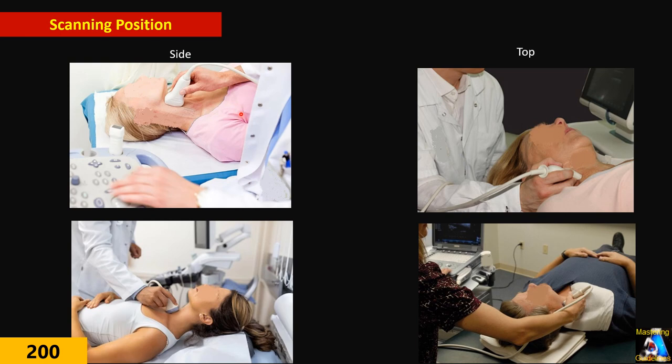Don't lean all your arm over the chest of the patient, especially with elderly people. Many of them are not comfortable and may not tell you anything, but they don't like it. For those using the side scanning technique, I recommend standing, because in that case your hands don't need to be abducted too much and anchored over the patient. Make sure your body is in neutral position, and adjust the bed height, your machine, and even standing height. You can sit on the chair higher — it looks like you are hanging your arm instead of bending and anchoring your hand and arm over the patient.